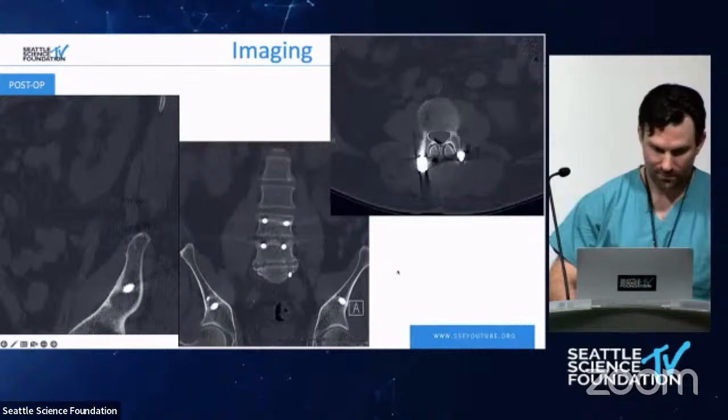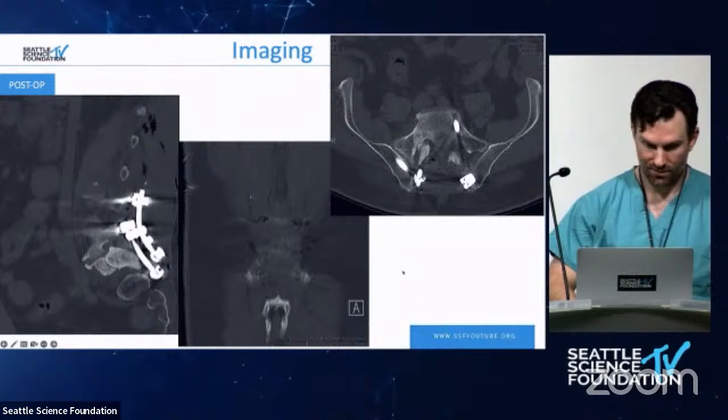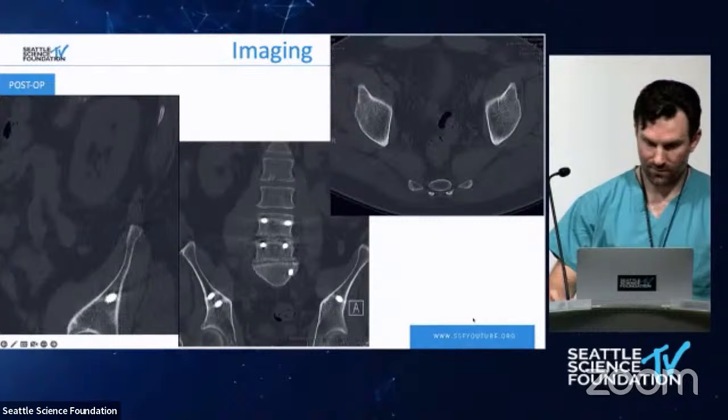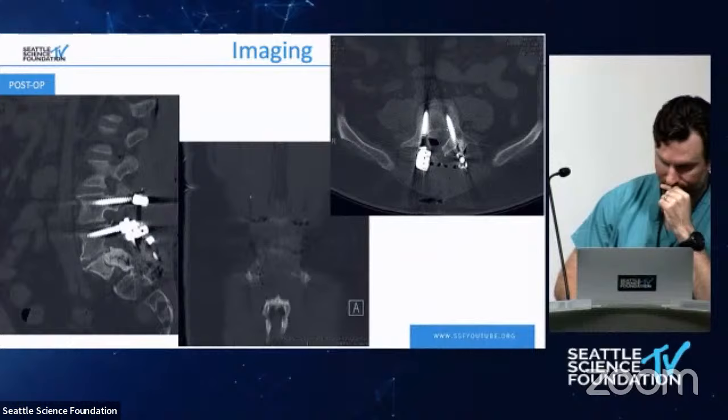And you see we got good fill with our PMMA in that dead space. So Rod, we filled up, or we tried to fill up the cavity with cement. I liked it as dead space management. Is that nonsense? What do you think about that? We had an intraoperative specimen sent off, and pathology came by and felt this was a metastatic lesion. So at this point in time, this is kind of a damage control, mobility oriented procedure.